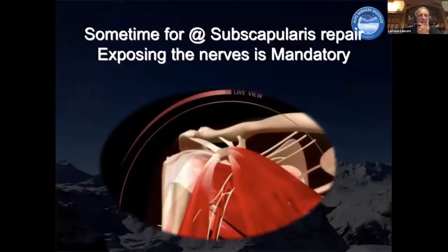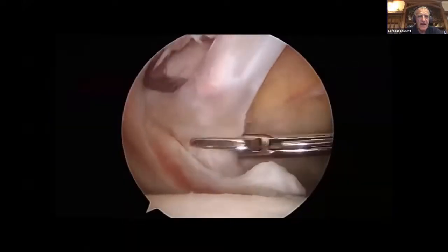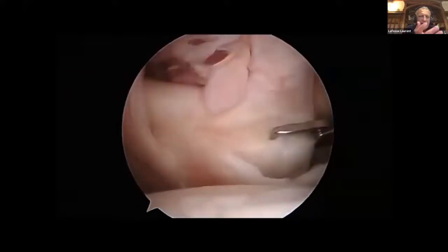So is it mandatory to expose the nerve? This is a very old slide, even Flateau many years ago at Val d'Isère, maybe 20 years ago, when he showed the release that I am doing now from the nerve, and everybody is scared for the nerve. But when do we have to go to the nerve and release? That case is a typical case where you have to release.